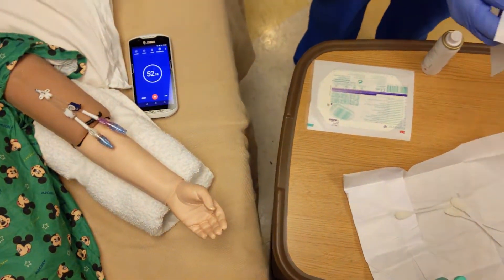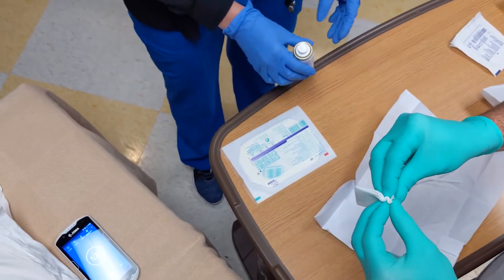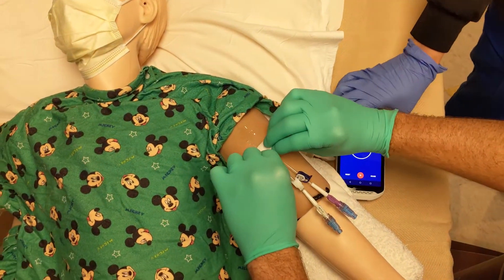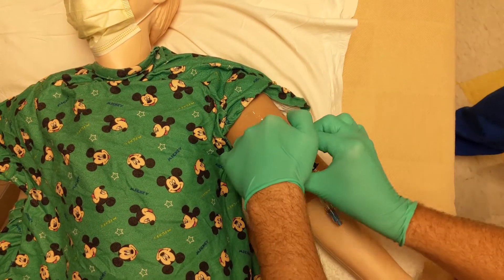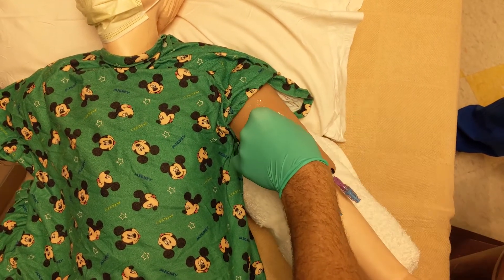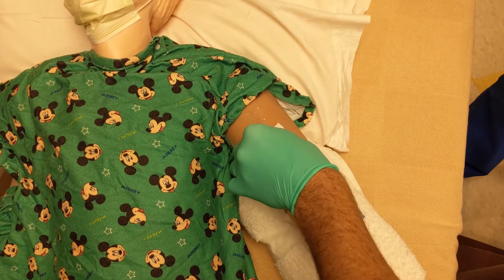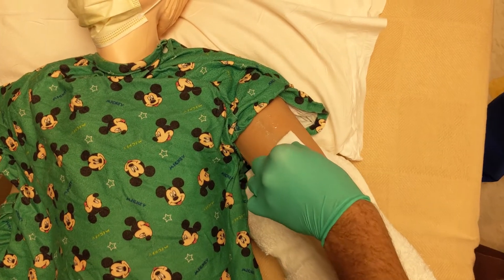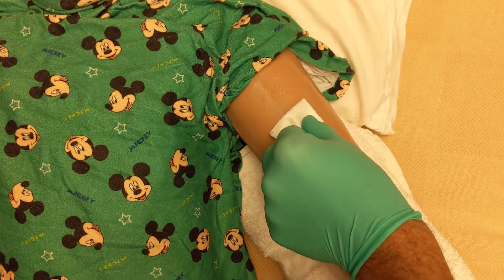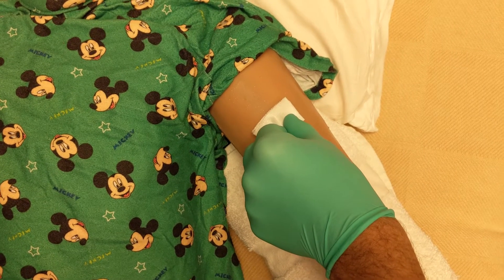While it's drying, your second person can get the sterile gauze ready for you. It may come with several pieces of gauze in the package, but you really only need one — it's best if you only use one. Fold it over once and place it over the center of the central line. This prevents the line from getting accidentally dislodged when you're removing the dressing, because it prevents the dressing from sticking directly to the line. Next, take your barrier spray and spray it around the side of the central line, making sure you don't get it directly on the line. This is just to protect the skin from the dressing and help it stick.